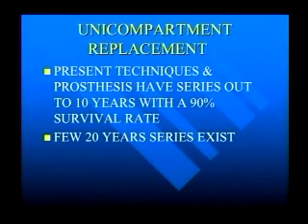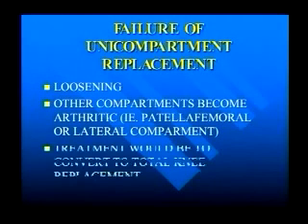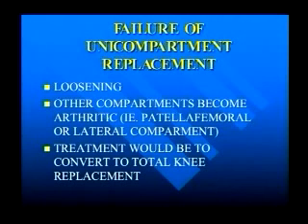If partial knee replacement fails, then it can fail because it loosens, the cement doesn't hold it. The other compartments, the lateral or the patellofemoral compartment, can become arthritic, so you have to convert it to a total knee replacement, and that's basically what you do. It's not that difficult to convert a partial to a total.